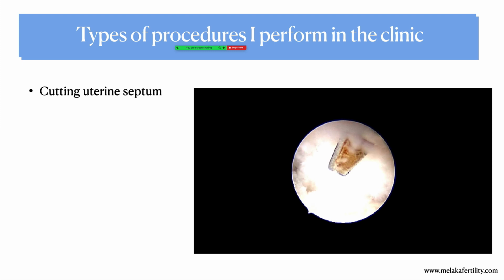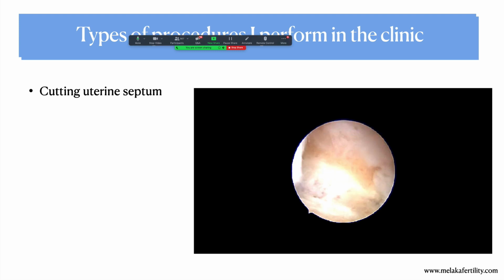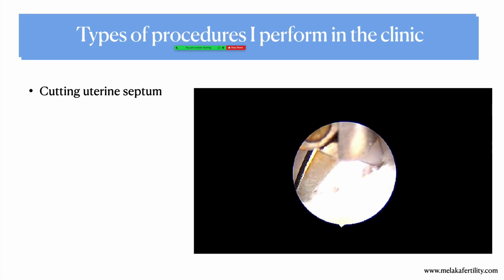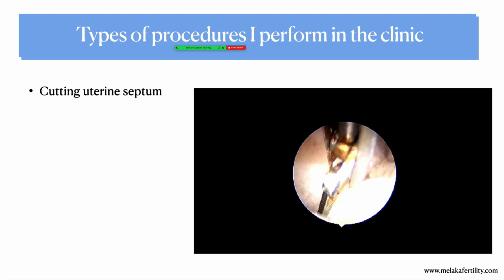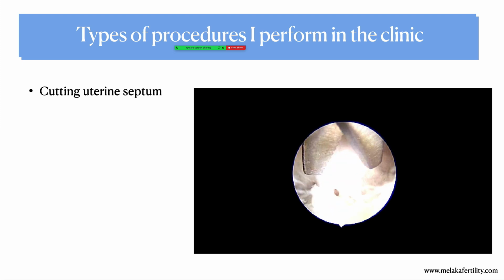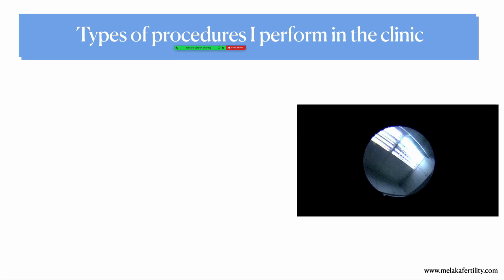I did it up to the level that I'm comfortable. When there is a slight bleeding seen at the end, I will stop. I bring the patient back and relook at the septum to see whether it is sufficient for the patient to conceive. So this is another procedure that we can do in an office setup. I'll move on, my time is almost up.